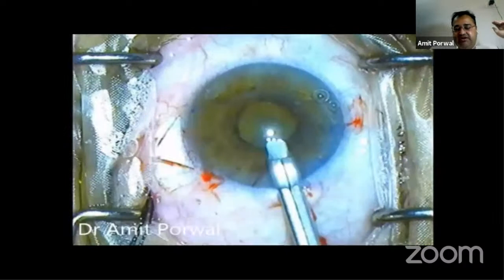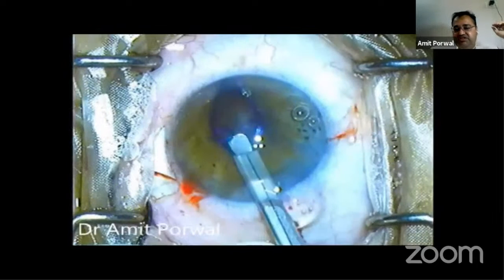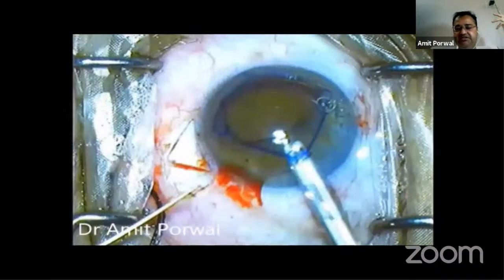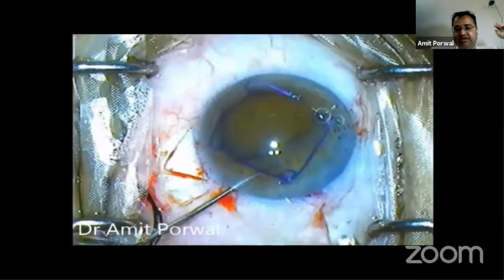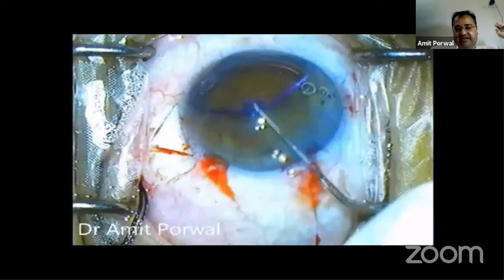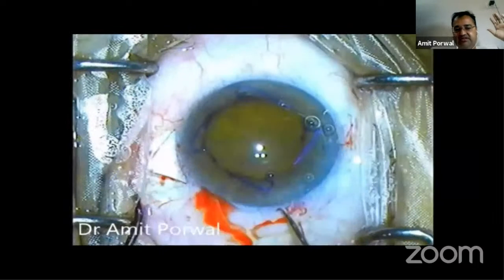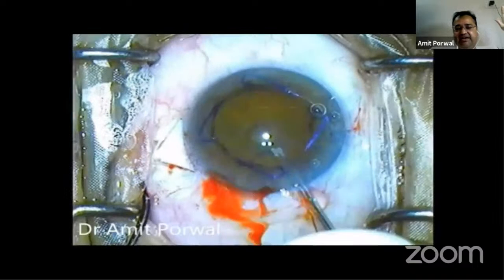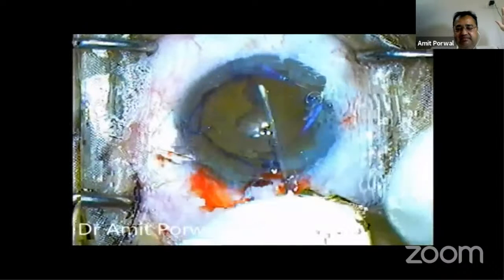Now the beauty of this pupil expansion device, the Malyugin ring DX or the OAS iris expander, is that it can be injected through the same main incision that you have made, so that you can inject this device and then fix it against the pupillary border. There are different techniques for different devices. Ultimately, the main aim of all these devices is that you should have a 5.5 to 6 millimeter centered, well dilated pupil. With this device, you can see that the pupil is now nicely dilated and maintained.